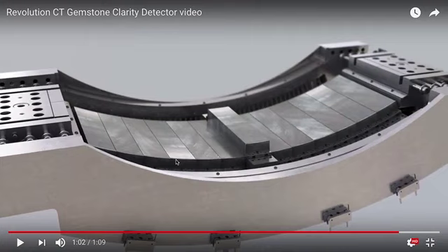It does both. If you have the X-rays on for a shorter time, you can imagine your dose would go down. However, there's a certain number of X-rays you need to get images of a certain signal to noise. Whether I get them over 200 milliseconds or 100, I still need to get them. So that is kind of fixed in terms of dose. The reason you want to go fast is to try and freeze motion.